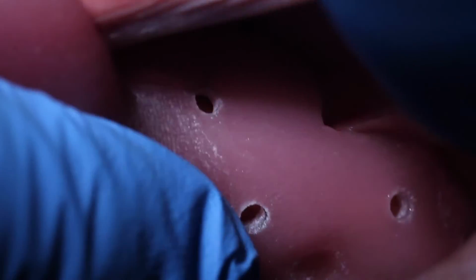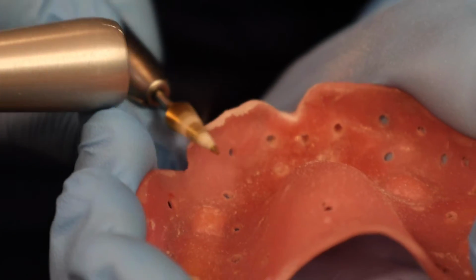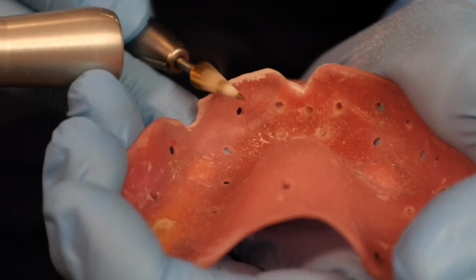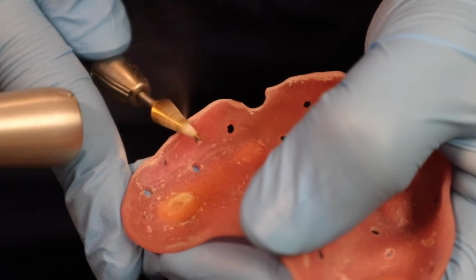So my tray is pushed down, my tray is pushed down back there. See, I'm just pushing down on that cheek. And so that means I have to adjust, because if my tray is being knocked out of the way, that means the denture will be overextended there. So I'm going to first make sure my tray has shorter extensions.